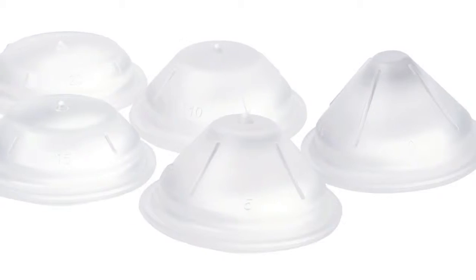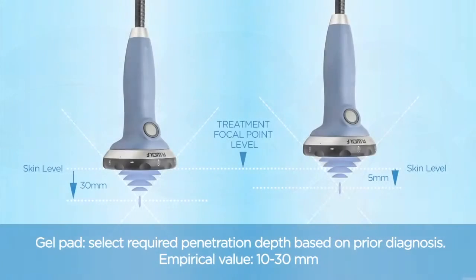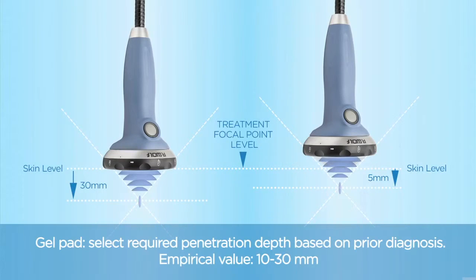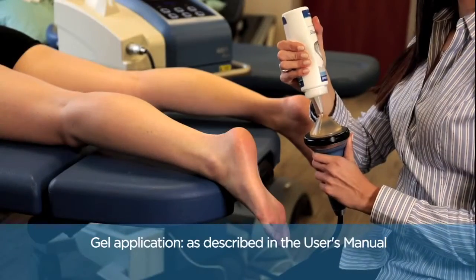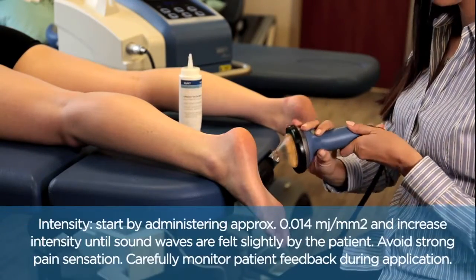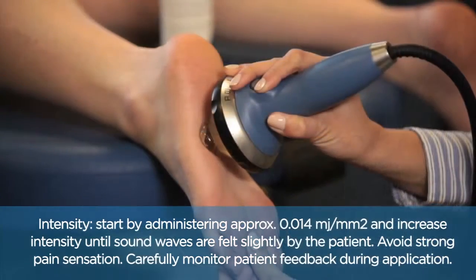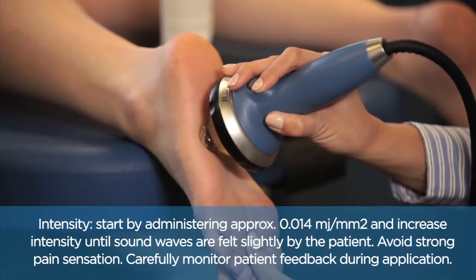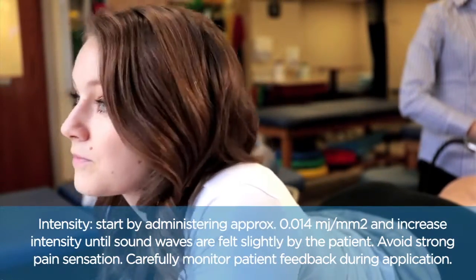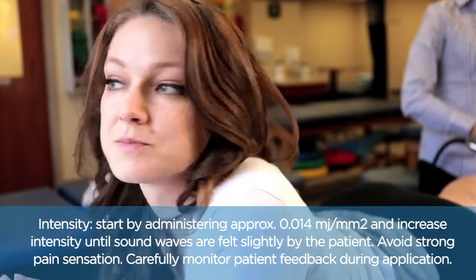Treatment: Select the required penetration depth based on prior diagnosis — empirical value between 10 and 30 millimeters. Apply gel as described in the user's manual. For intensity, start by administering approximately 0.014 millijoules per millimeter squared and increase until sound waves are felt slightly by the patient. Avoid strong pain sensation and carefully monitor patient feedback during application.